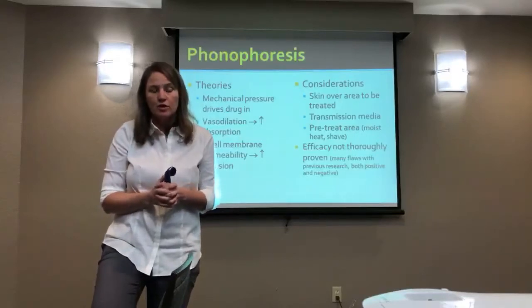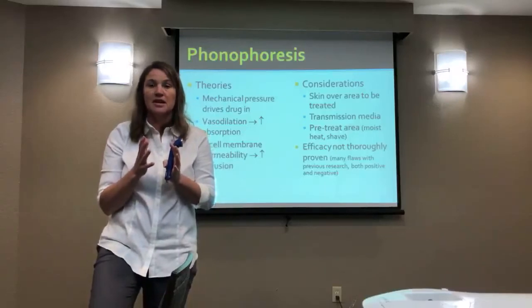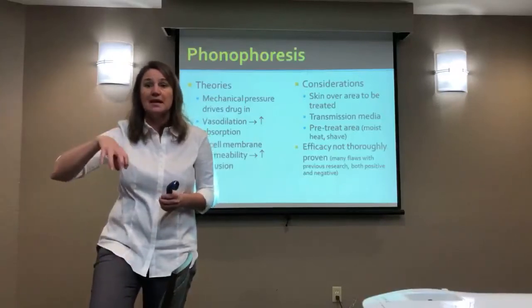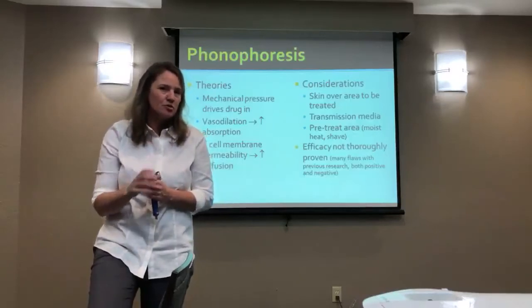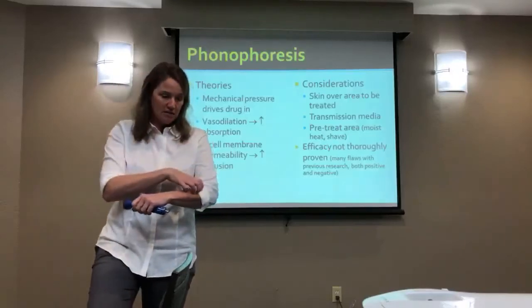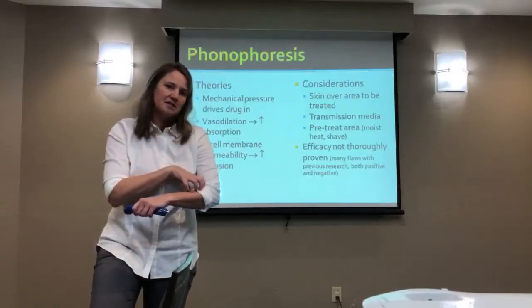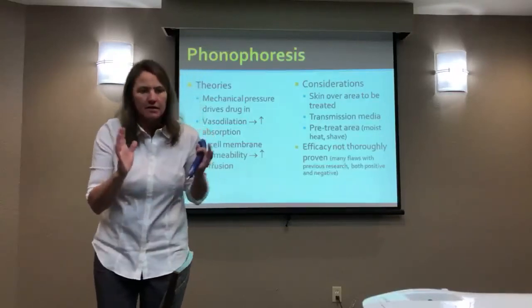So really, if you were going to do it and you really wanted to establish some sort of consistency, it would need to be done in a lab. You'd have to have somebody make it for you, or you'd buy it at a proper dilution so that you at least have some control over how much drug is in contact with their skin. Either that, or you put it on their skin, allow it to penetrate, and maybe put a barrier over it, and then ultrasound over that. That way the drug itself is against the skin, and it's not being diluted. Again, if you're going to use it.